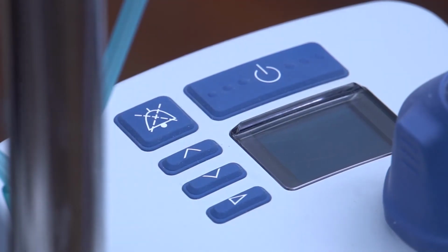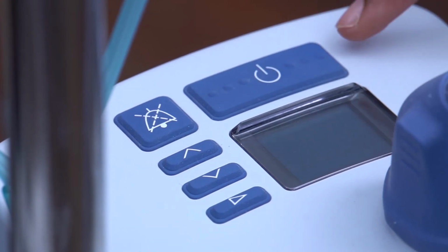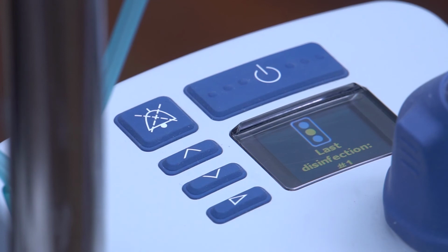Once everything is ready, press the button on the device to switch on. Then the main screen will light up. In this high flow machine, we can adjust 3 parameters. One, temperature. Second, airflow. The third one is fraction of inspired oxygen, FiO2.